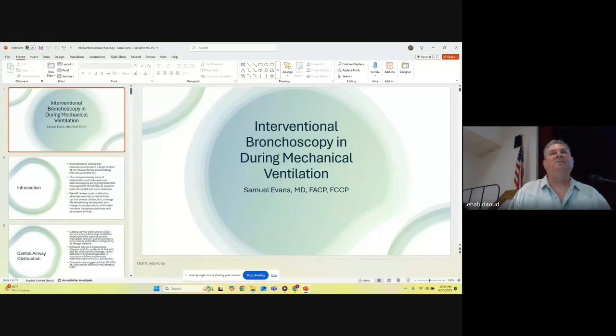I mean, there's definitely some situations where the physician needs to look at the patient and decide, is it actually safe to do the bronchoscopy or not? So sometimes I just say no because I don't want to kill the patient. My question is, what's your view on just doing a bronchoscope versus having an RT do a mini BAL? I think mini BAL is a reasonable thing to do if you know where you are. I like doing the scope and having the CT so I know exactly where I need to go to do that lavage and I get it from the right spot.